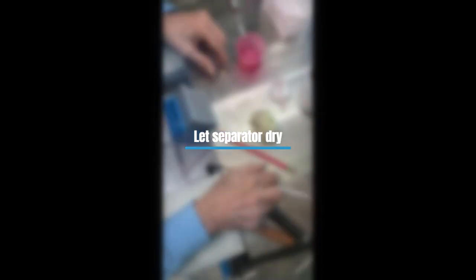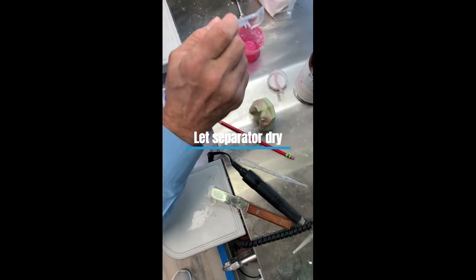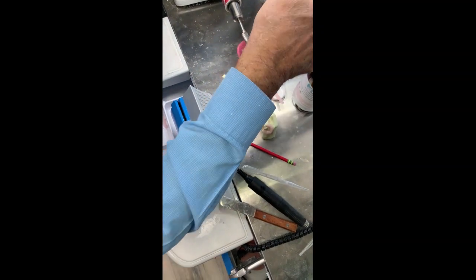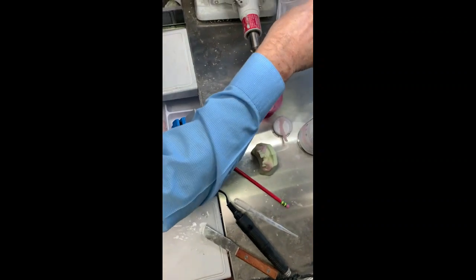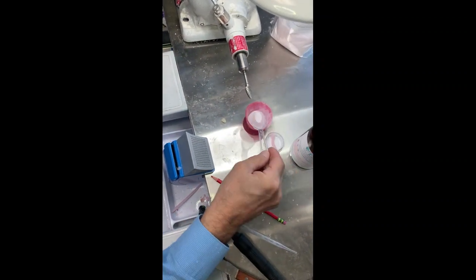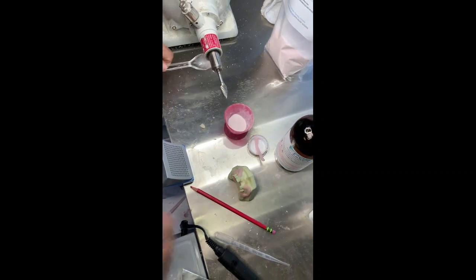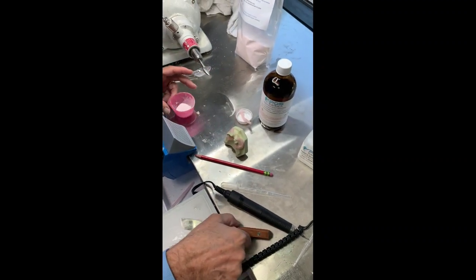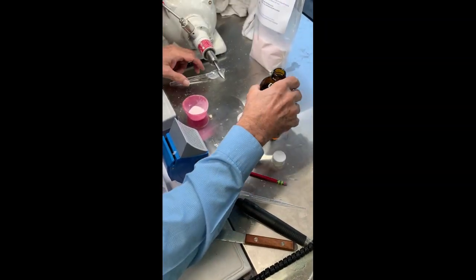Okay. While the separator is drying, it's a good time to start your mixture of your acrylic. You go ahead and pull out what you're going to need. This is our standard pink. We do have measurements for this. I eyeball it, but we do have a measurement. This is our monomer.